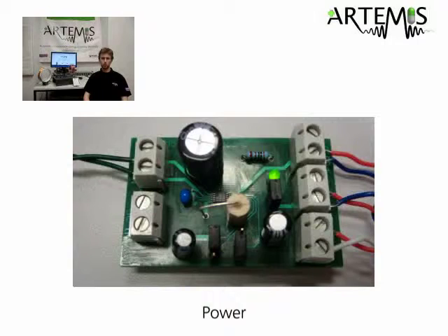The circuit is capable of converting the input voltage from the coil, which will be AC, to a stable DC output that can be used to power the microcontroller and all the devices in the capsule. In addition, the device stores the unused energy in the capacitor, so if the inductive link fails, the capsule will continue to operate for a short period of time. All this circuitry was necessary in order to wirelessly power the capsule and achieve a power transfer of 25 milliwatts with porcine tissue.